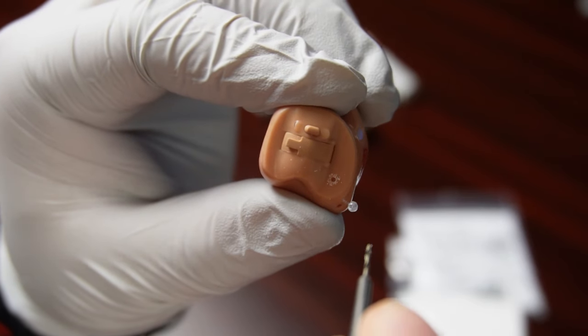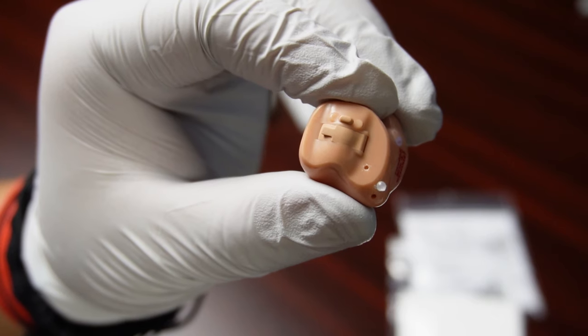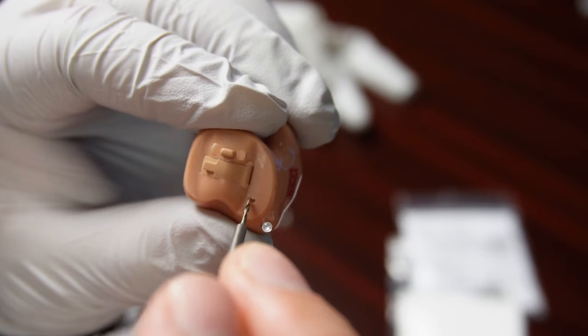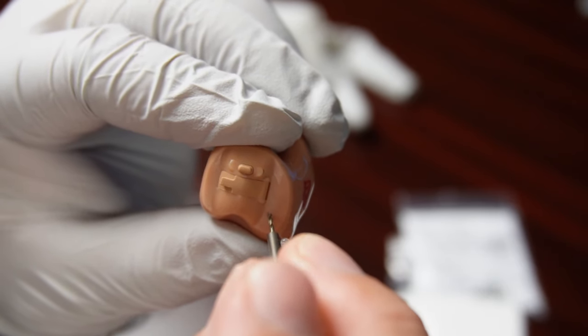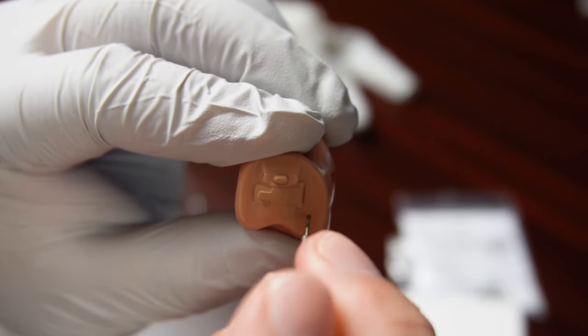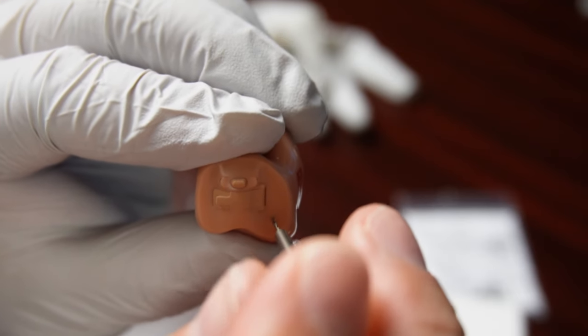Make sure you don't press too hard. Make sure you're patient. Don't rush it. And just try to keep it as straight as you can, as perpendicular to the faceplate as you can. And then before you know it, all of a sudden you'll break through. And that's why you don't want to be pressing too hard, because you don't want to plunge the drill bit all the way through and damage the hearing aid.